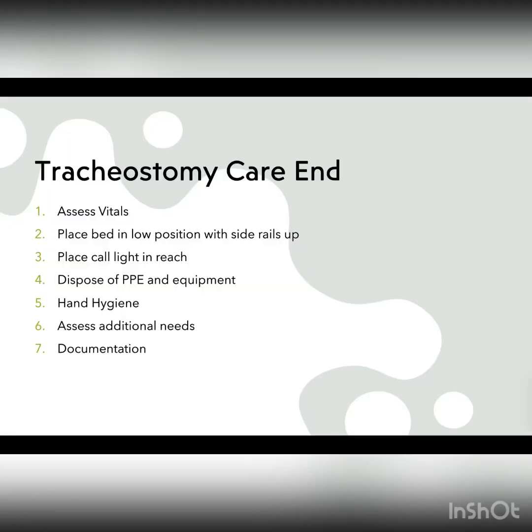After performing a thorough trach care, just like how we assess the vital signs and patient status before the procedure, we also want to assess the vital signs and patient status after the procedure as well. After that, we want to return the bed to the lowest position with the side rails up. We want to place the call light within reach.